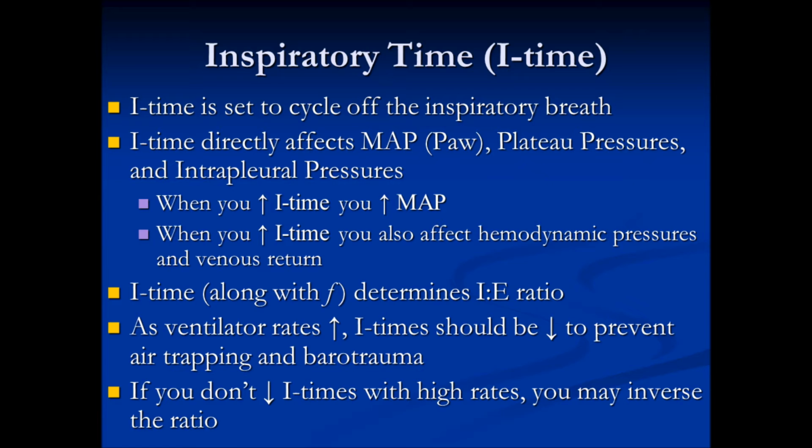So I time, along with your rate, will determine your IE ratio. Finally, something that helps determine the IE ratio, just as we spoke about with your frequency.